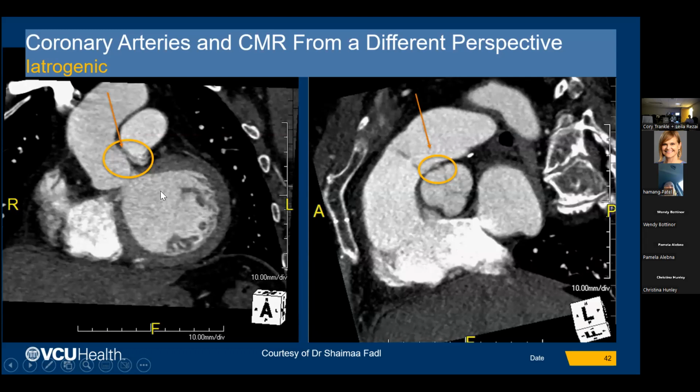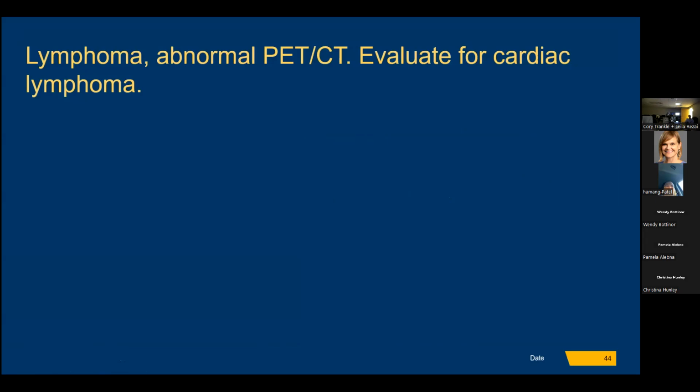Here, a patient was referred for a coronary CTA, and we can see that the origin of the left coronary artery is stenotic, it's narrowed and slit-like, and this is what is contributing to the positive stress test. She still denied being symptomatic, so she's being considered for extra testing for evaluation of that.